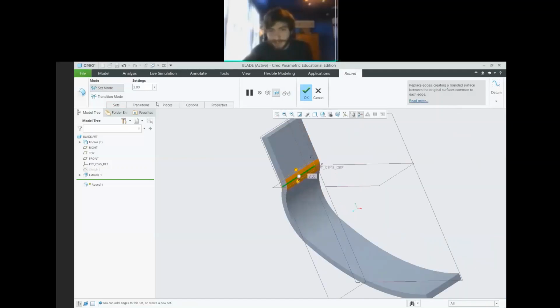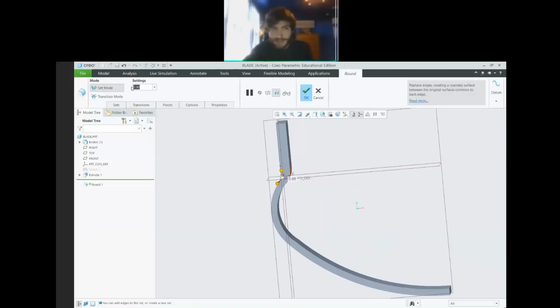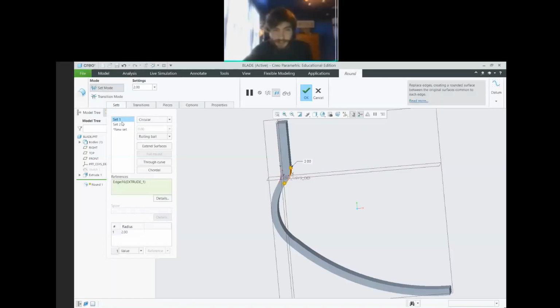One somewhat annoying thing is you see how I click 2 curves? If I change this number now, it only changes the second one. In order to change them both, you have to change it in here, I think. So this will change both. No, it'll only change one. You have to do it twice, because for some reason they're different sets. Again, I don't know.